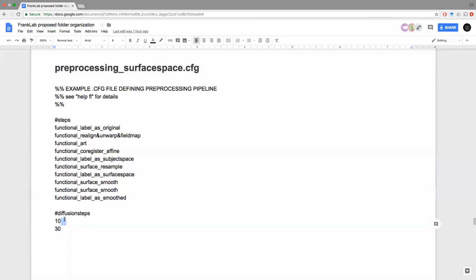For that, you typically want very low smoothing because you care more about the spatial specificity than about the power of your analysis. But for more subtle questions, when you're looking at subtle effects or differences between conditions or between groups, then you care about power a lot and you want to maximize power as much as possible, and that's why you do smoothing.